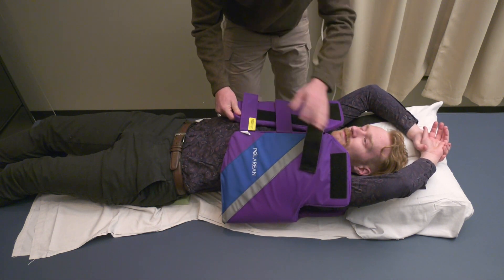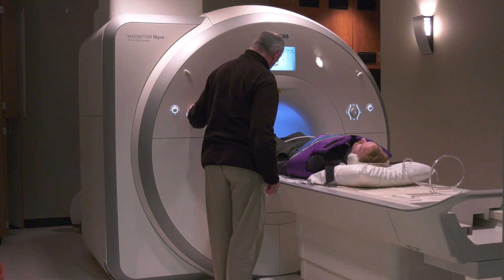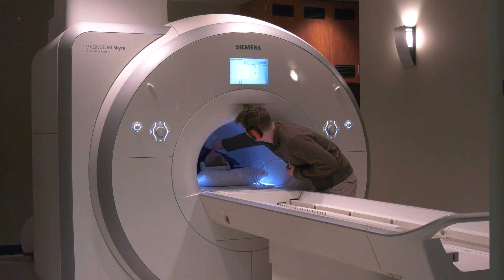After the vest is wrapped around the participant, they are rolled into the MRI machine with their lungs in the center of the scanner. A member of the research team delivers the xenon to research participants while they are lying in the MRI scanner. To standardize the images, the research team member delivering the gas coaches all participants using the same commands.